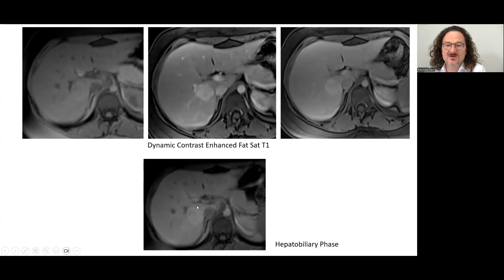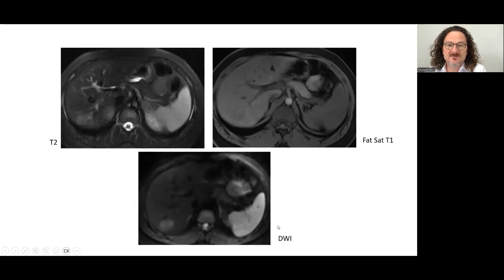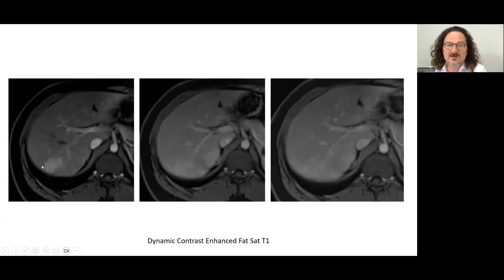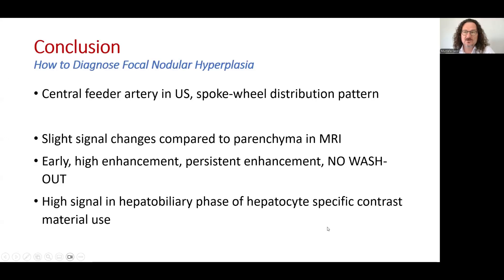In the late hepatobiliary phase image, the lesion enhances more than the background parenchyma. This was a difficult case: a slightly hyperechoic lesion, very difficult to recognize on T1, with very mild diffusion restriction. Early arterial enhancement is visible, becoming isointense with the background parenchyma, but with no washout.